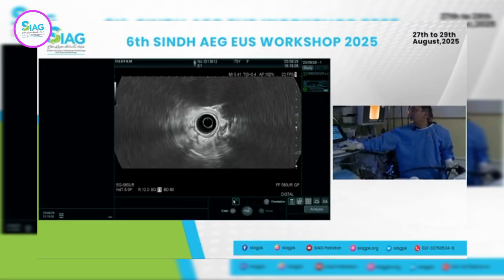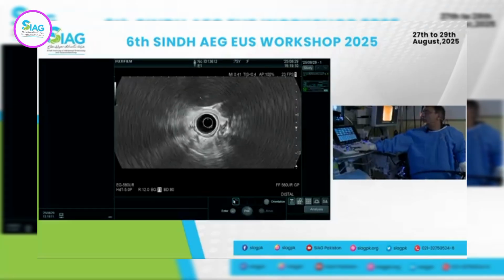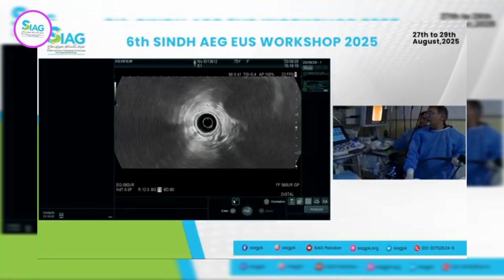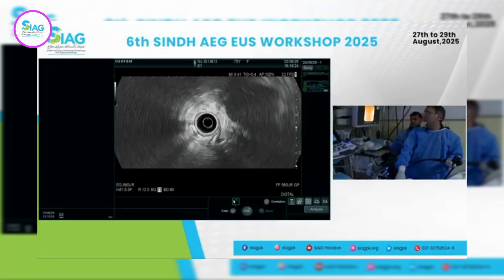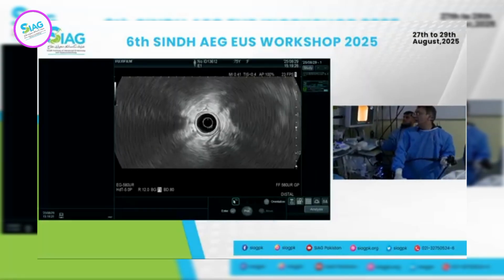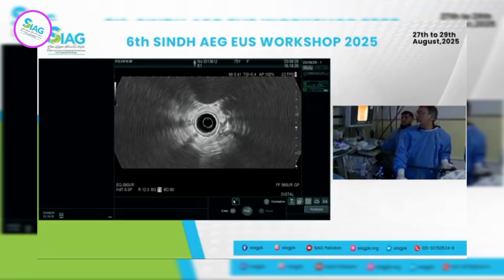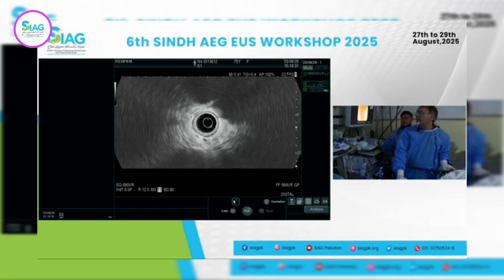So here, I made the image quite small only to show where the bladder is. You see the bladder right there, a black structure. Earlier it was on the side; you can do that as well, and that gives you the patient's position, the way they are lying left lateral, but I usually put it on the top. So that's the anterior part of the rectum. I'll keep that on the top and then keep pulling back.